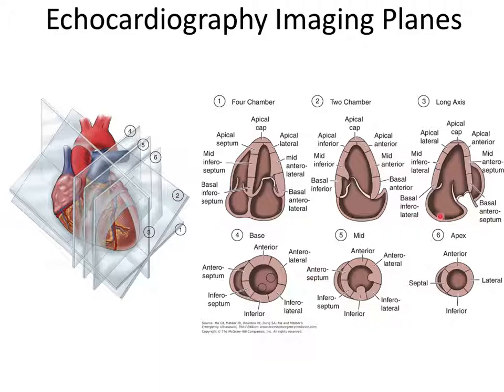Okay. The other thing that is labeled on here, and we'll look at this in greater detail, are big segments. So you cut the short axis into 6 different regions. And you have these big chunks, the anterior lateral, anterior, anterior septal, inferior septal, and inferior. And then inferior lateral. So you cut the septum into 2 big chunks, the free wall, or the lateral wall, into 2 big chunks, and then the anterior and inferior.